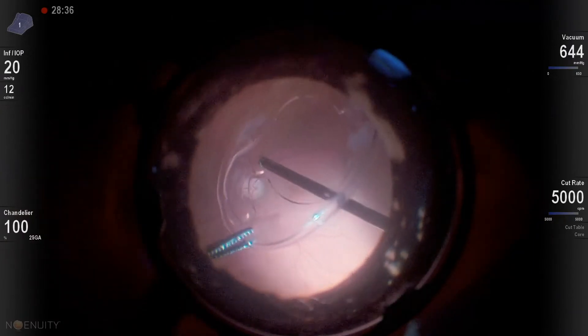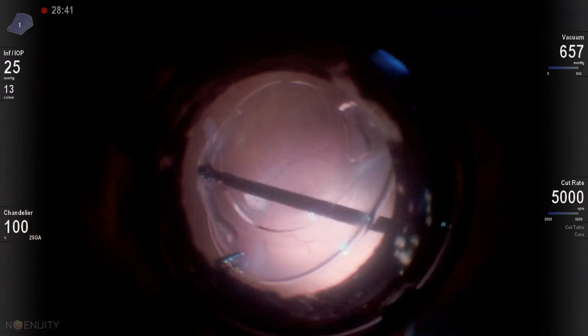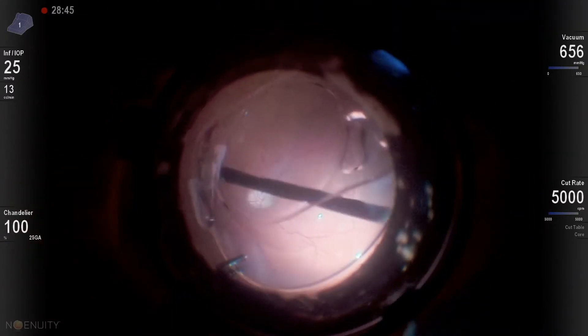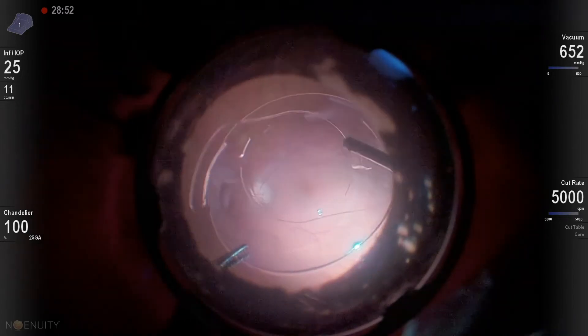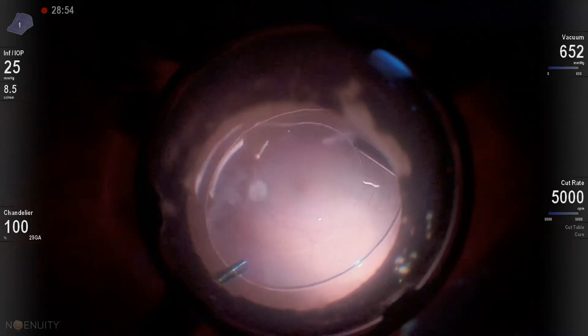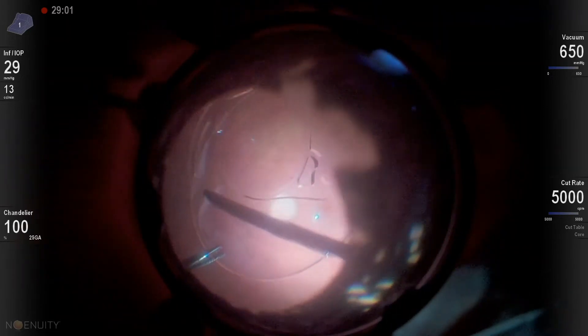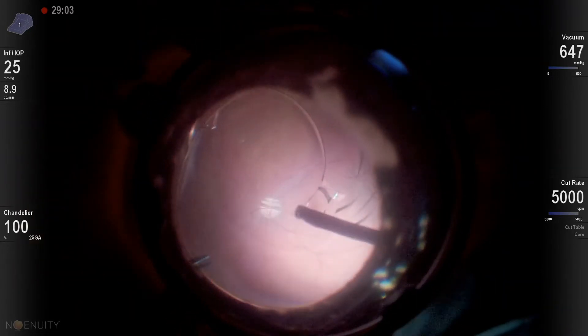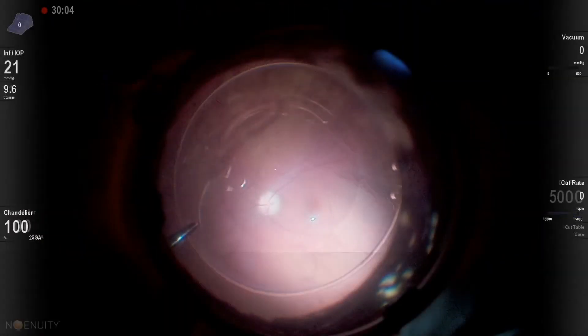My plan is to fixate a Carlevale IOL. I am using a 23-gauge cutter here, so there will be no issues removing the remnants of the capsule and freeing the lens. I am using PFCL to protect the posterior pole — it is debatable, but it gives me confidence that there is a cushion so that if I drop something it will not hit the macula directly.